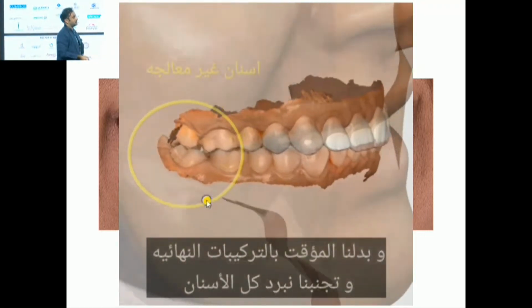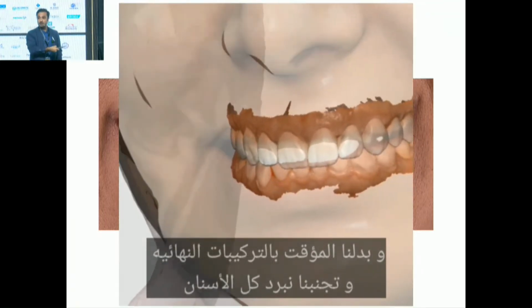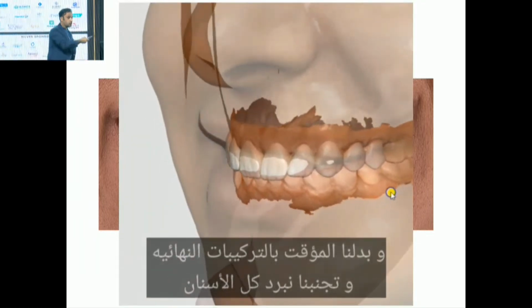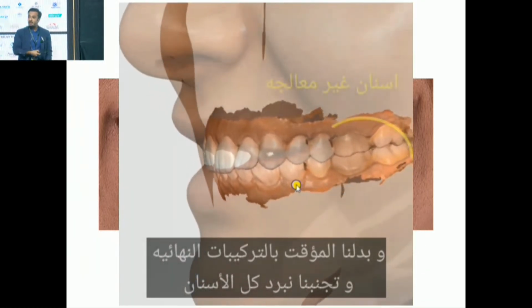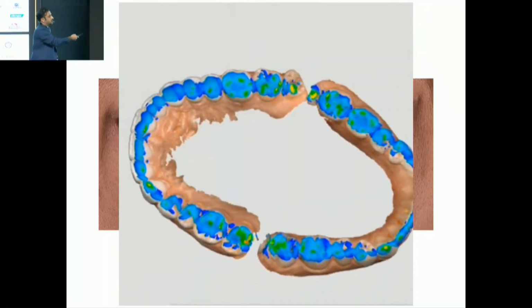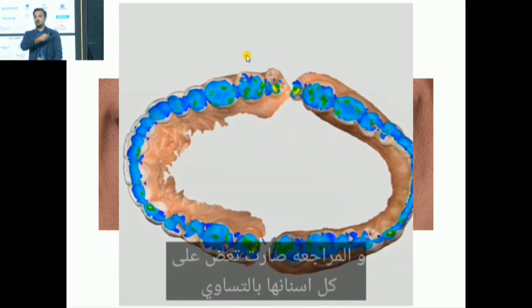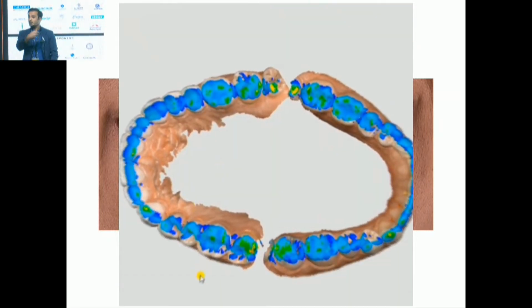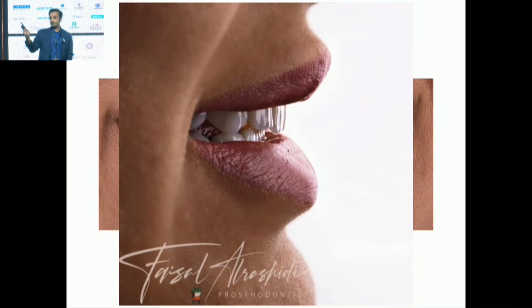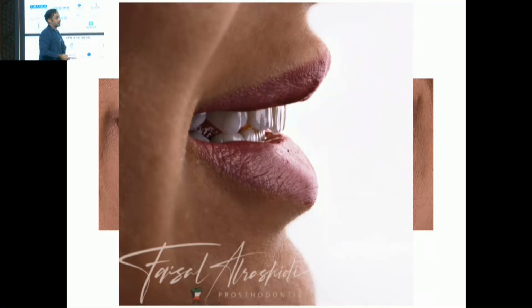Not only that, we can take the impression, we can assess if we had proper occlusion or not. If the occlusion is correct, is it properly distributed or not? And you can see in this that after we establish the occlusion, you have multiple occlusal contacts. This is what we thrive for, right? As prosthodontists, getting the proper occlusion there. And with the help of digital dentistry, we can achieve that.